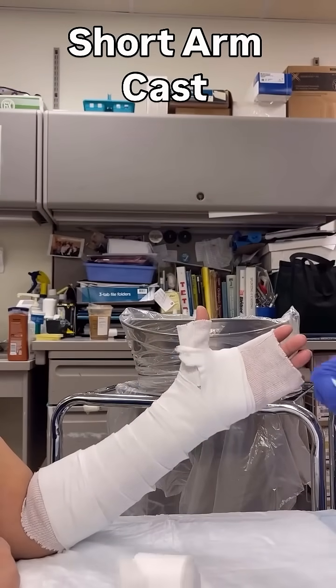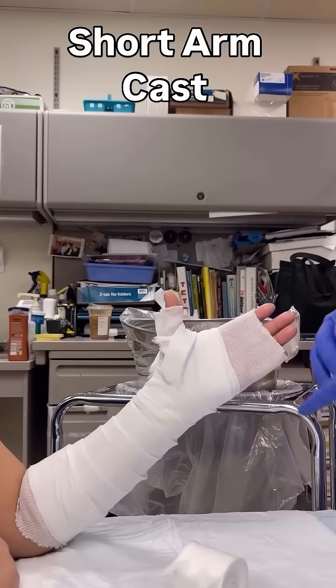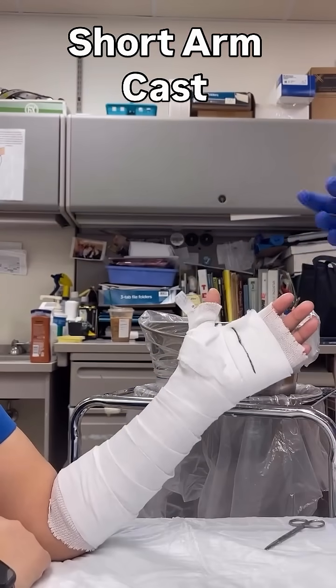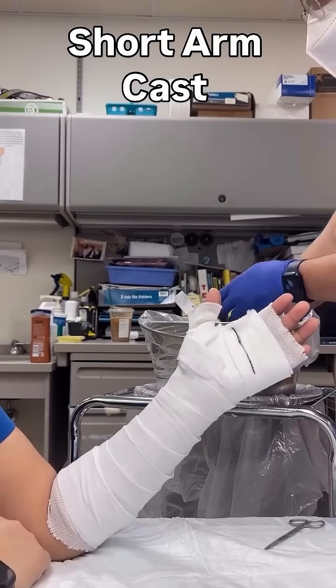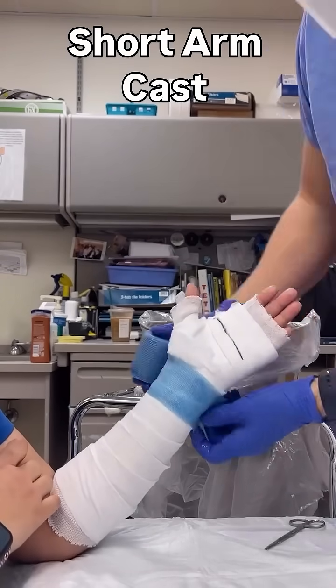Tear a few strips of web roll and fold them over to place around the thumb as well. In this case, I supplemented a few strips of web roll around the metacarpal heads to have a little extra to fold over and keep that edge well padded. I also marked the area of the palmar crease to know how far distal I need to go with the fiberglass.